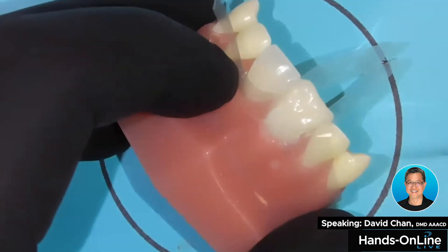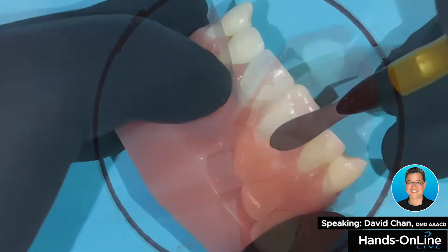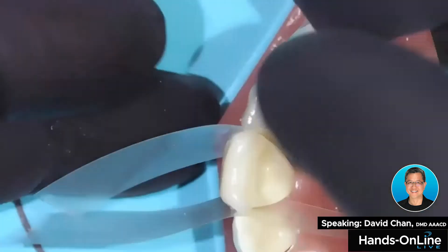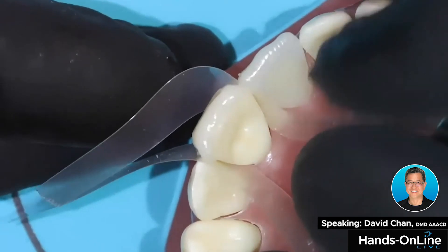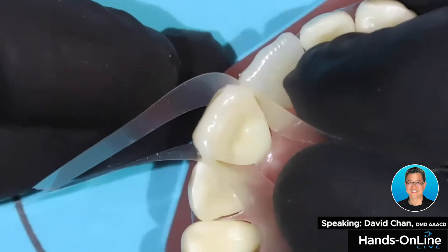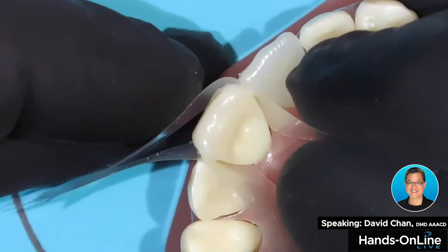Then I just spread it out. This is called a pull-through technique, and I'm going to do it for both mesial and distal. Let's start with the mesial. What I do is I grab the palatal portion of the mylar. Now remember, this is in the sulcus. I'm going to drag — watch what happens to the composite — I'm going to bend this facial portion.